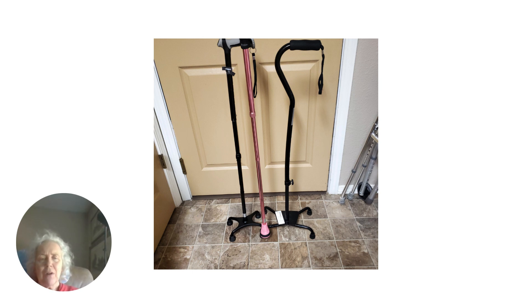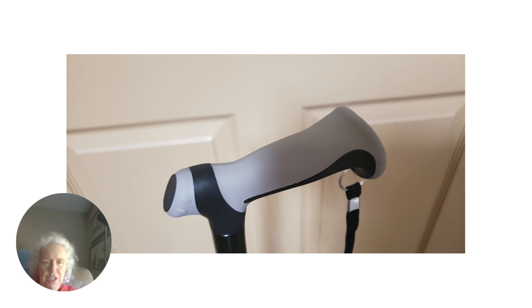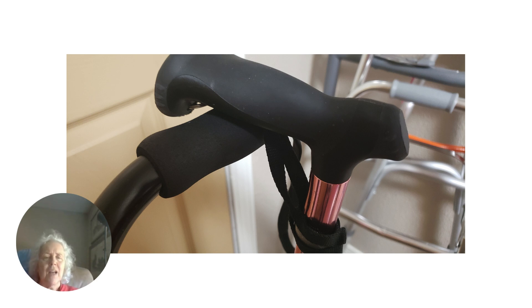These are the two quad canes I was talking about. You see how the left one has a much smaller base. ReHand is the brand, and this one on the left is just awesome. It's adjustable height, it's got a nice foamy grip handle that's molded to your hand, so it's comfortable and easy to use. It will hold 350 pounds. This is the handle on the single point, which is also custom fitted — compared to another brand's quad cane that just has a straight, non-molded handle. It was much harder to use than the ReHand one. What a huge difference the grip makes.